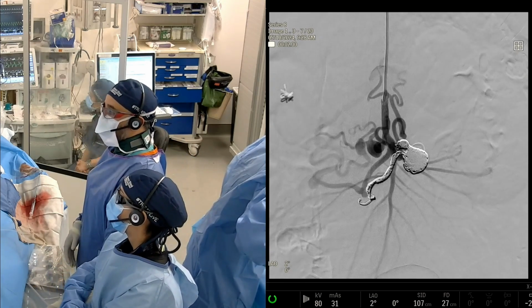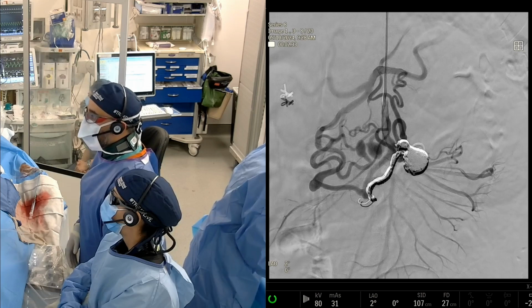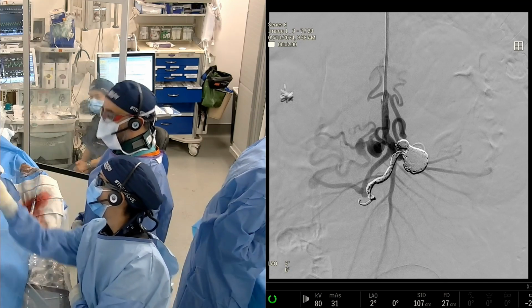So now the question is this one pretty smoothly. I think we're going to try and go after the second big one here and try to figure out where it's coming off. Yeah, I think those two both look the same, like they share. Yeah, potentially, maybe.